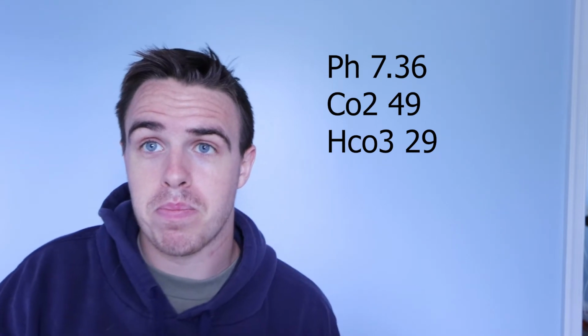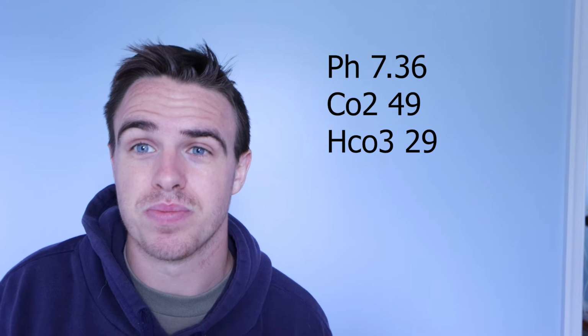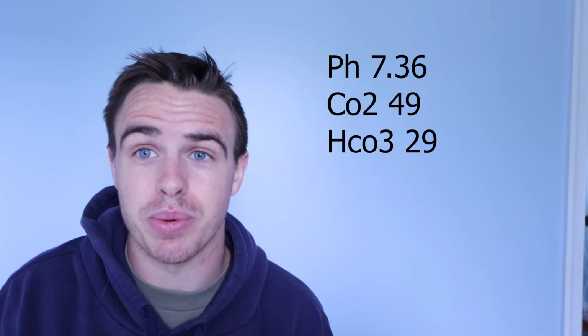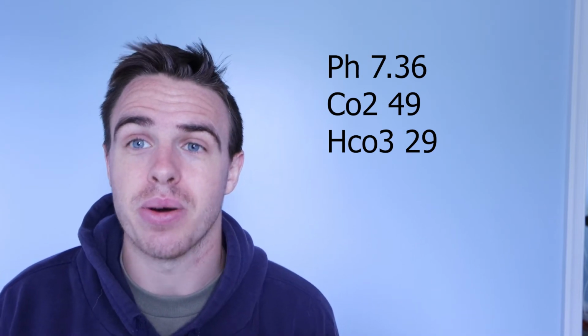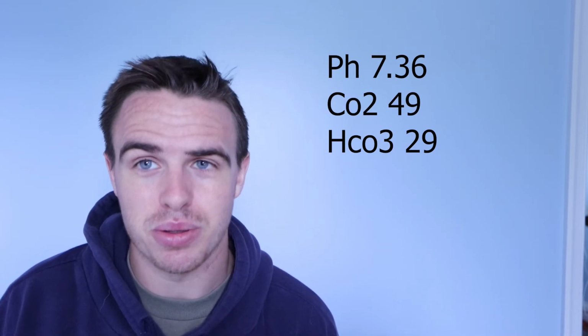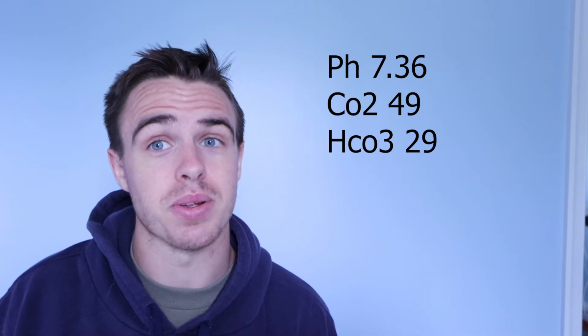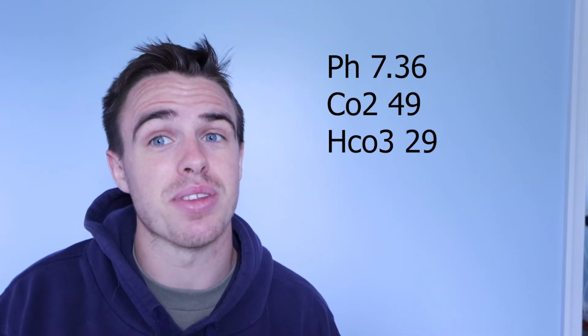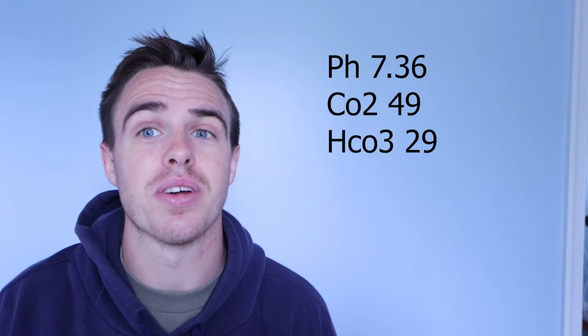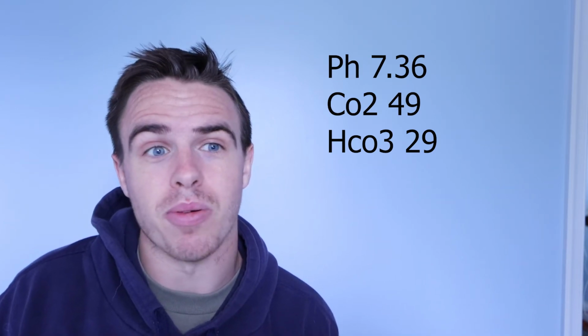The bicarb is basically compensating for that high CO2. So we look at this one and say, okay, the pH is normal range, but once again the CO2 is out of whack and the bicarb is out of whack. But we can also see that the pH is on the lower end, so it's a little bit more acidic, but it's normal.